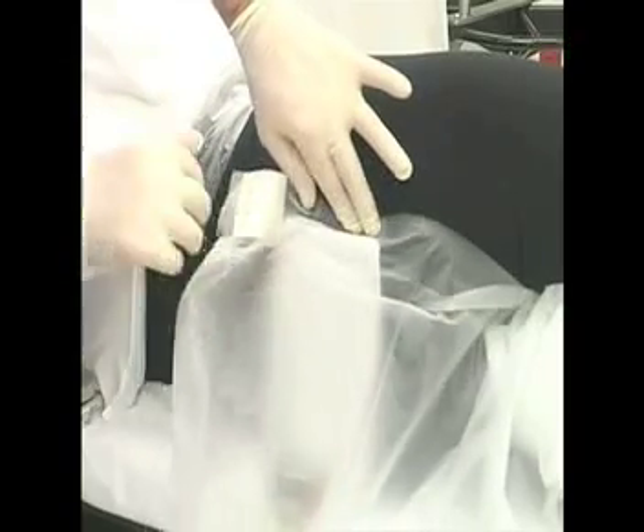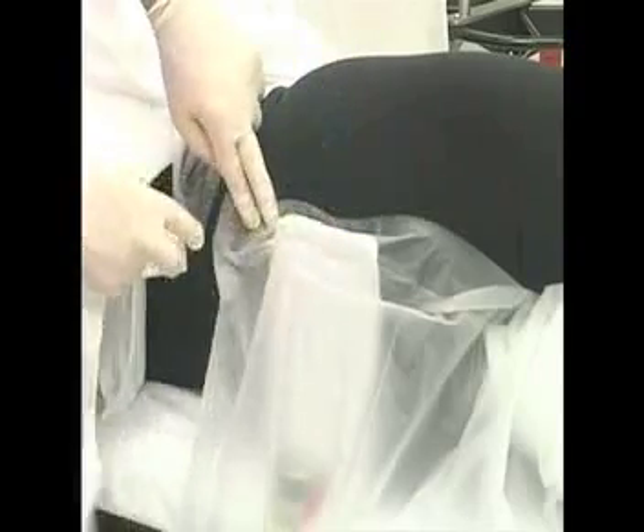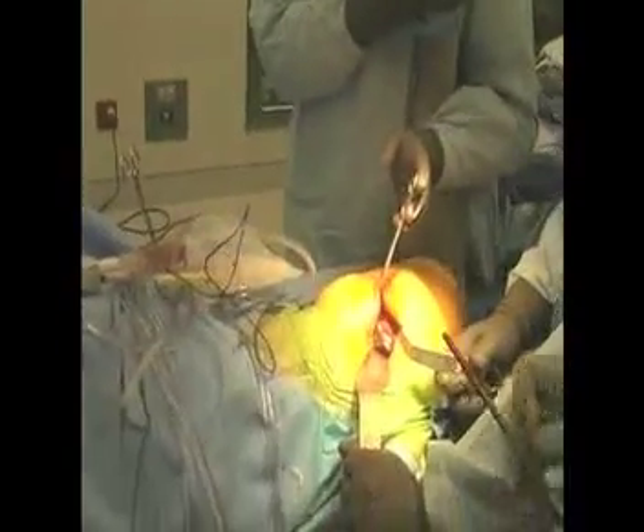Isolate the lower extremity with a U-drape to protect the Hip Grip from skin preparation chemicals, irrigation fluids, and blood.